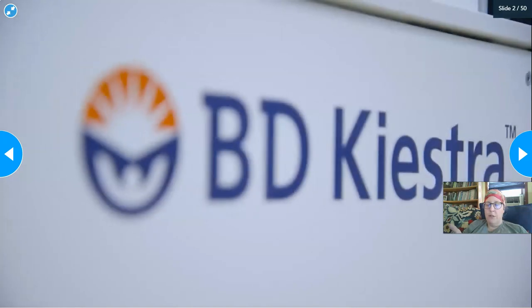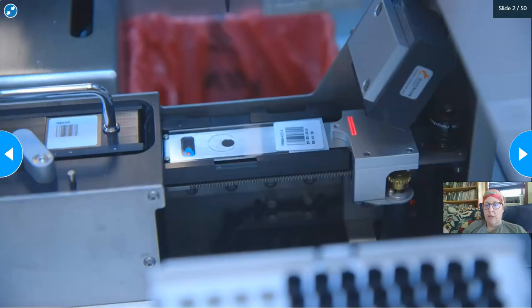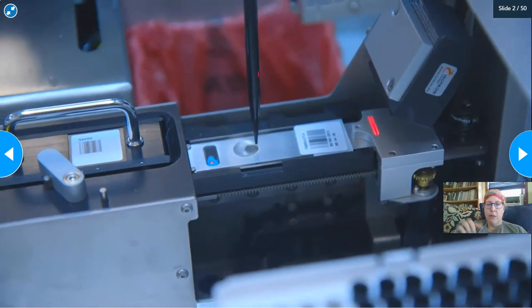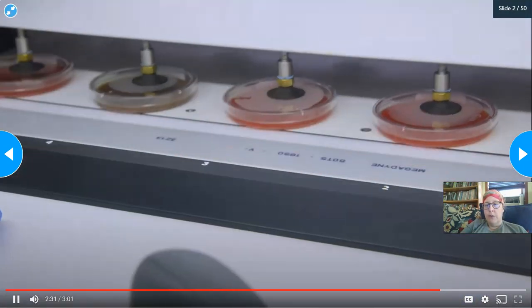Of course, she talks about here, basically, the sooner you get a proper identification of a microorganism, the sooner you can get a patient on the correct treatment. And so that could mean a shorter hospital stay for that patient, lower healthcare costs and all of that. You can see they're doing slides there. They can do gram stains and stuff. Anyway, this has been really revolutionary in micro.